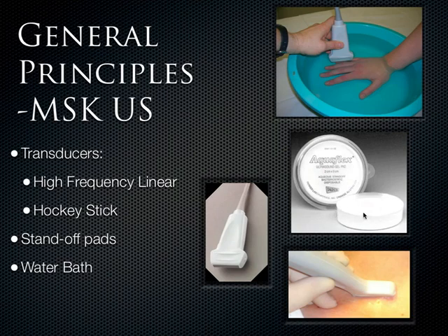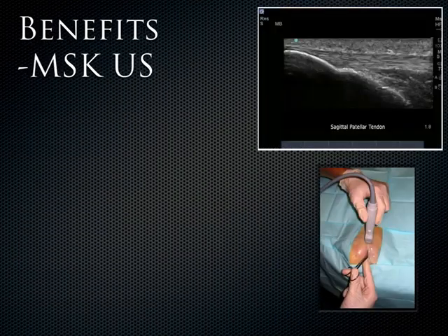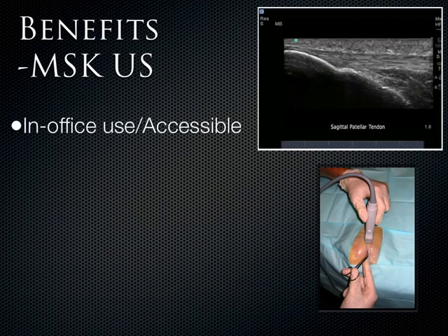You can even take a glove, fill it up with ultrasound gel, and you have an immediate standoff pad. And for the most part, we're going to be in 2D mode, though some of the pathology will require power Doppler to look for inflammation. Now, there are many benefits to using ultrasound.